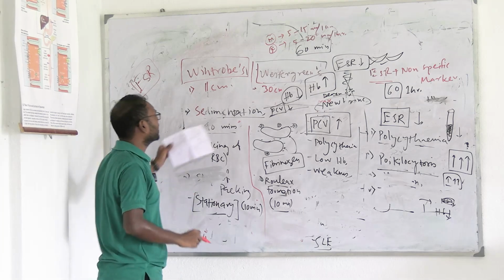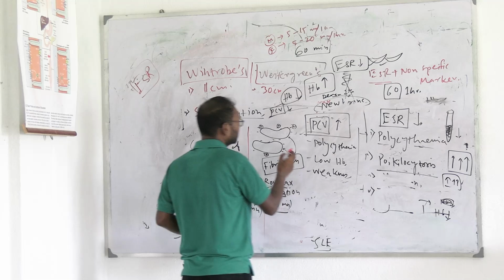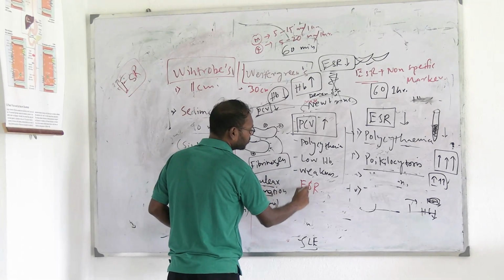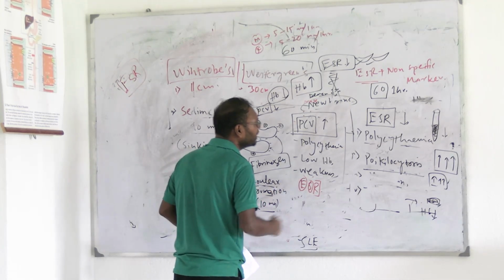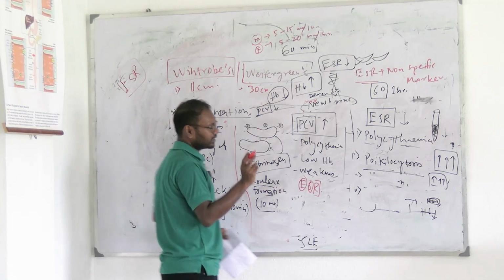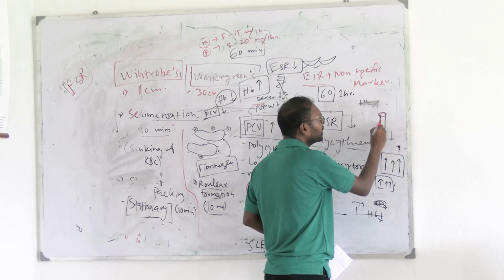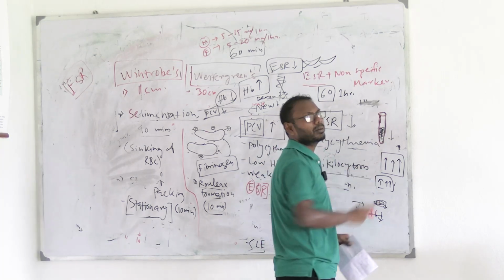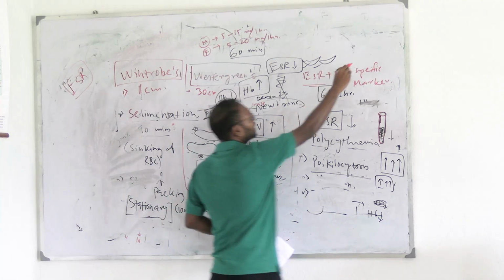Now what is sedimentation? We have to understand what erythrocyte sedimentation rate is. So what is sedimentation, why only erythrocyte, and what is rate, we will be discussing. First, we will discuss why it is called erythrocyte sedimentation rate when we are putting whole blood inside it. Now blood has which components? Tell me, what is there in blood? Plasma is there.